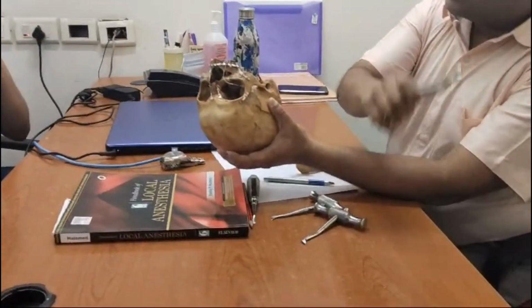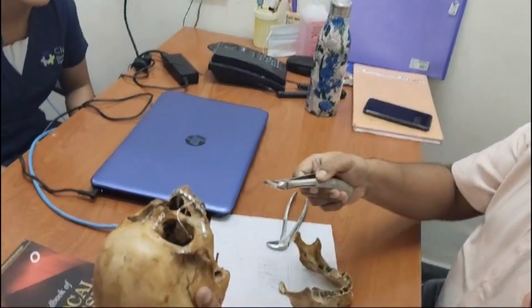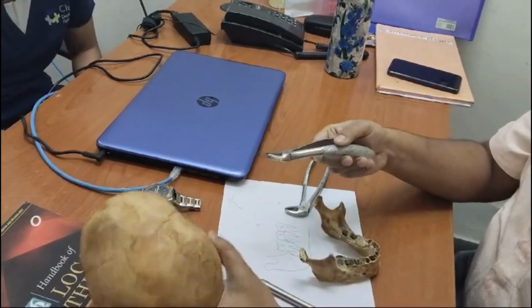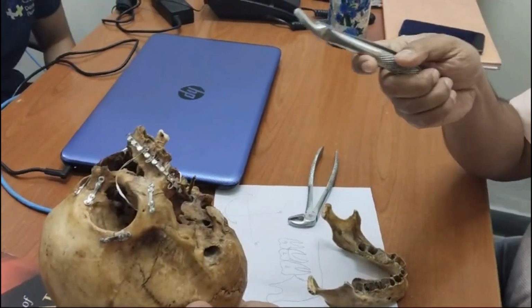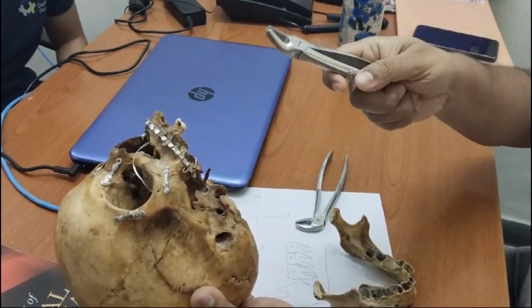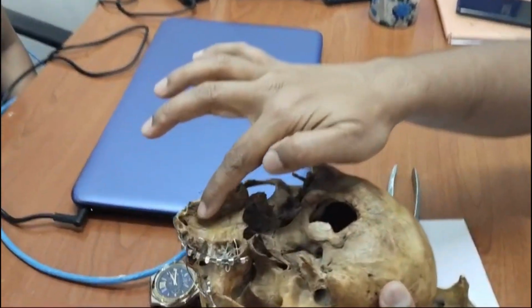So you use the maxillary forceps similar to the mandible. So this is a molar forceps. The molar forceps has a triangular beak which comes to the buccal bifurcation area. As I said, you have to interchange the forces. One is the buccal force, the other one is the lingual or palatal force, then slight rotation, and finally traction.